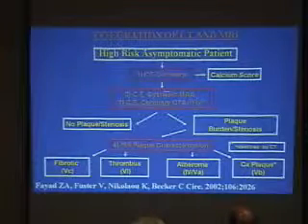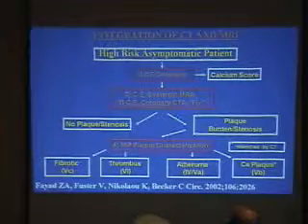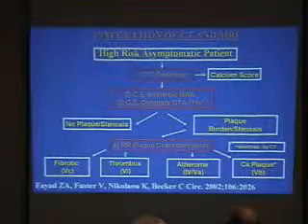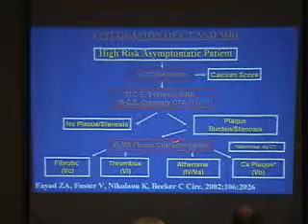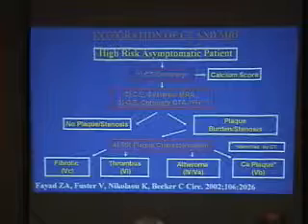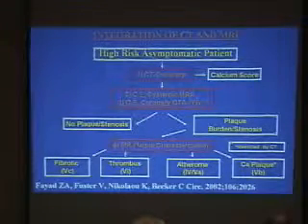The second is systemic MRA, injecting gadolinium in the vein to see the systemic circulation. Third, ultra-fast CT, injecting in the vein to see the coronary arteries. And fourth, to look with MR tissue characterization at the plaques identified in the systemic circulation with MRA or in the coronary circulation by CT.